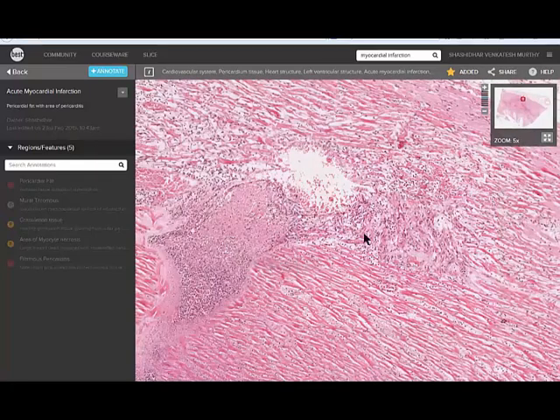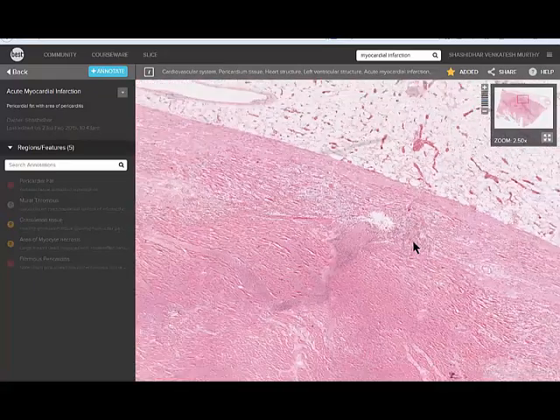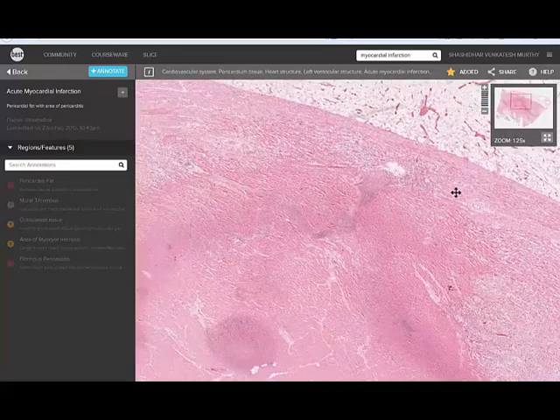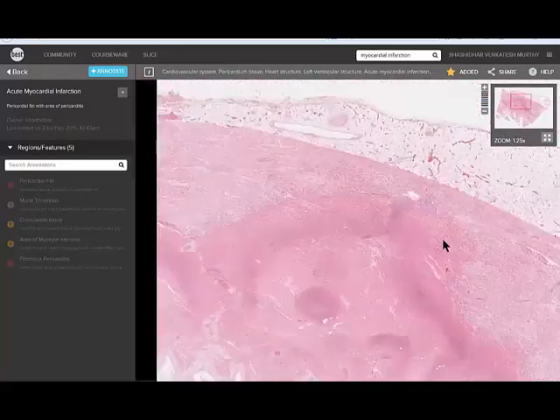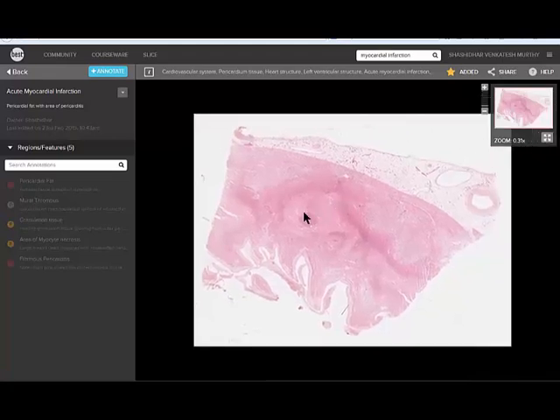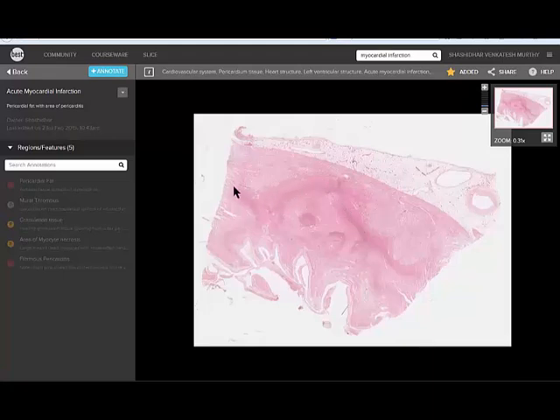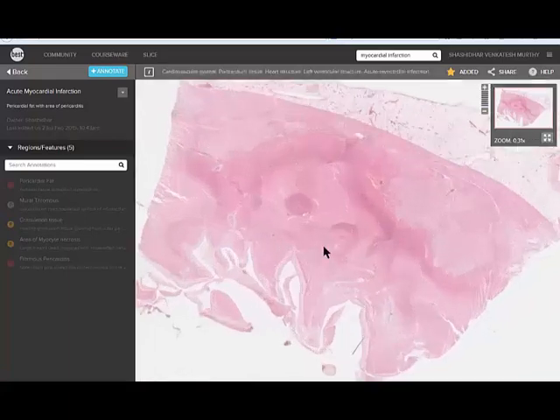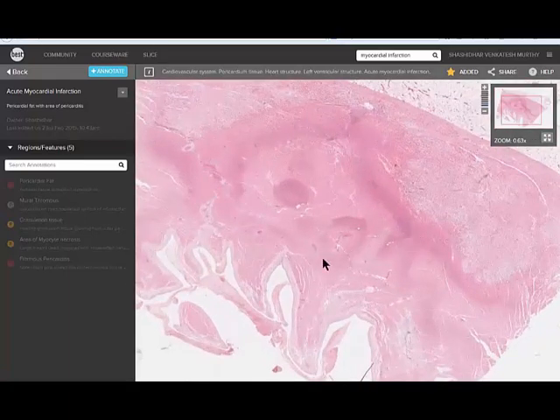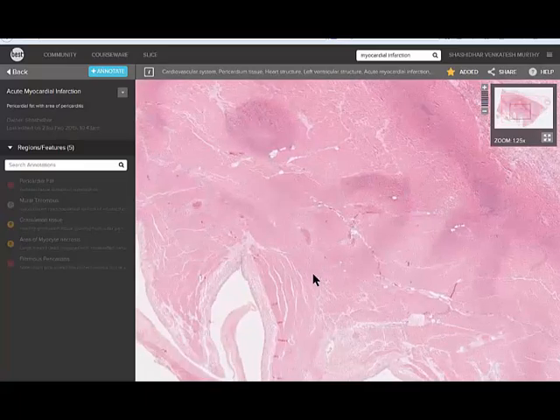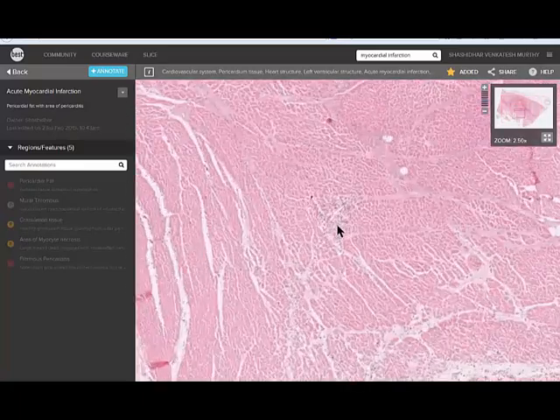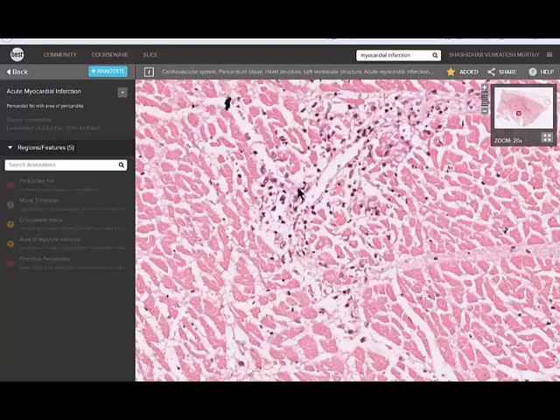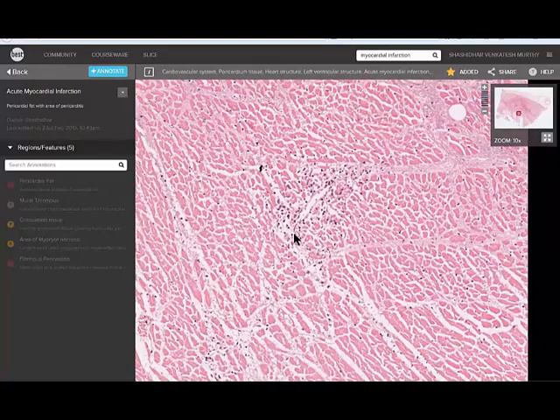Above this area is the granulation tissue. If I again come back to this, you are seeing in the low power view, the outer pericardium with pericarditis, outer area of granulation tissue, that's a healing tissue from there. Here is the necrotic tissue with inflammatory tissue because these are all dead muscle fibers with plenty of inflammatory cells, the dying muscle fibers, this whole area. And if we closely observe here, there are plenty of inflammatory cells in between and edema. Edema is separation of these myocardial fibers.